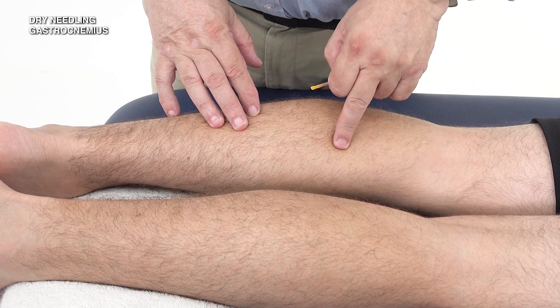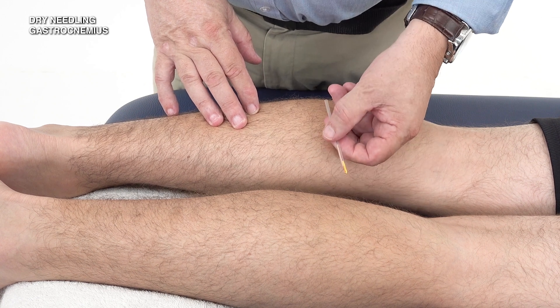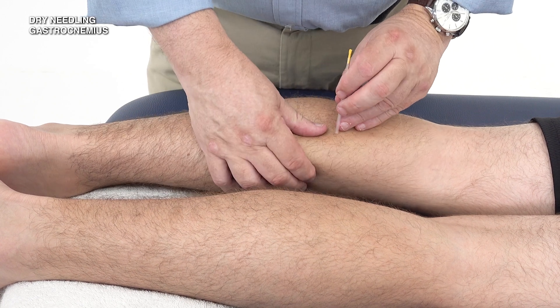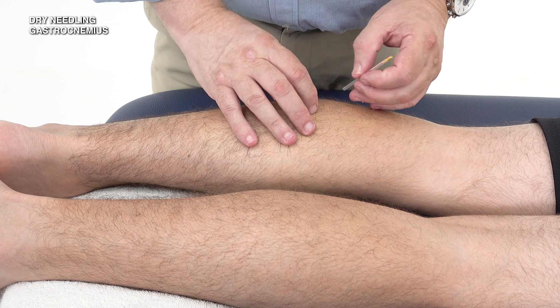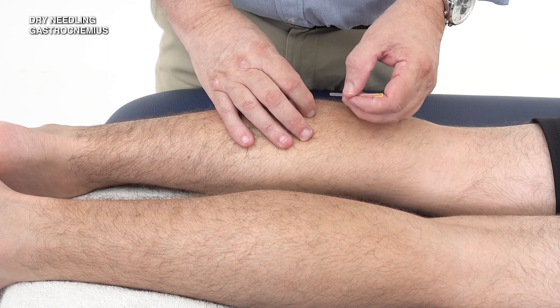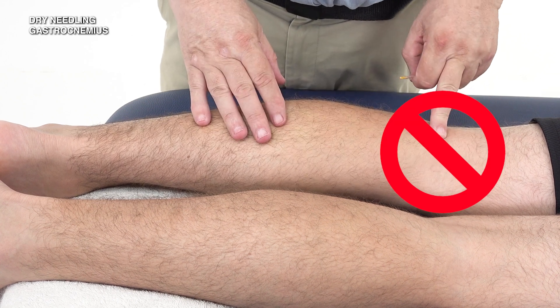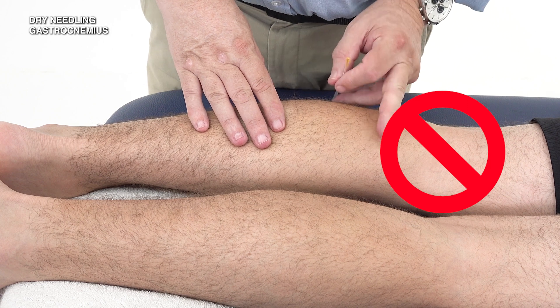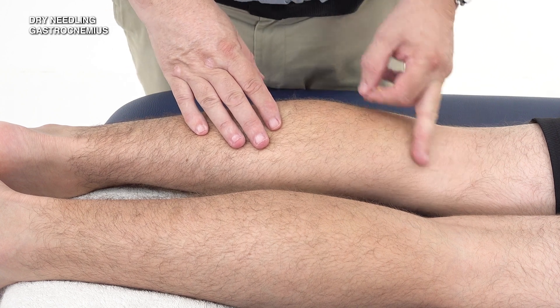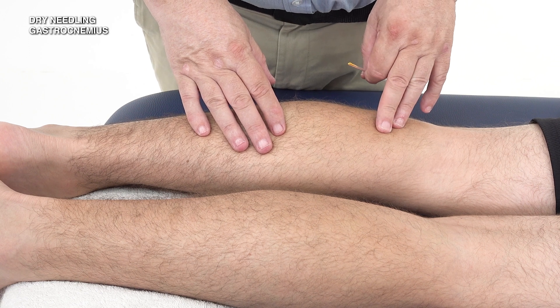We would identify the myofascial trigger point and insert the needle in a lateral to medial direction for the medial head, or a medial to lateral direction for the lateral head. You need to be careful not to go anywhere near the popliteal fossa — the same as for the hamstrings — staying below the knee in order to avoid the popliteal structures such as the nerves and blood vessels in the area.